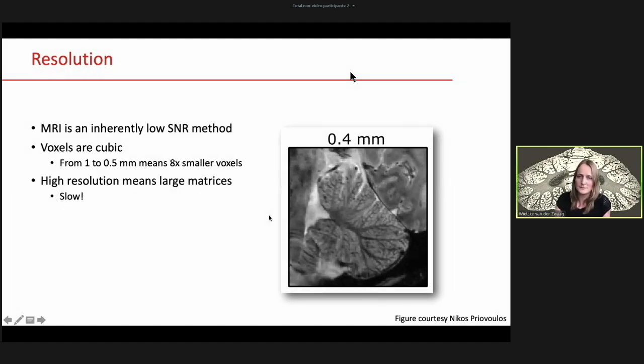the white matter. If we go to a voxel size of 0.4 millimeter, which is already much higher spatial resolution than we're used to, then we start to see that gray matter layer more properly, but it's still not quite sufficient. Now we can take one more step up in spatial resolution without our volunteers complaining too much, and then we get to a 0.2 millimeter voxel isotropic.